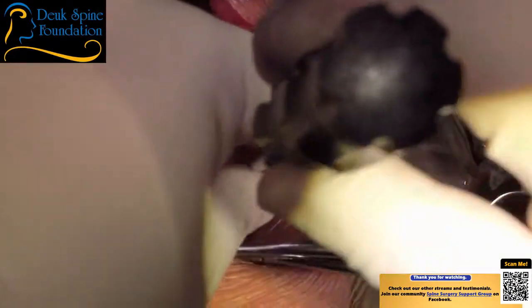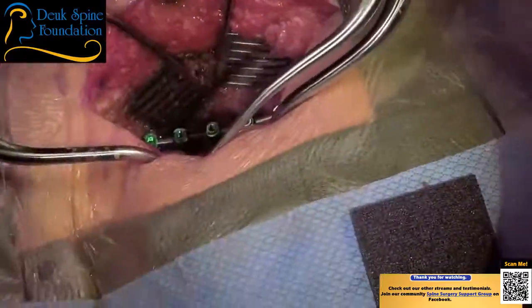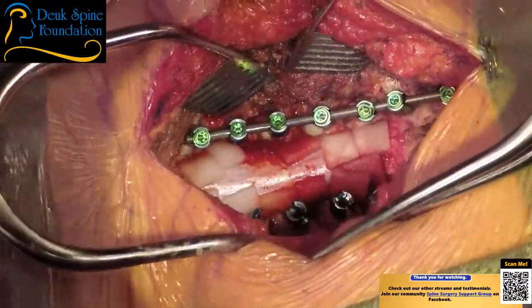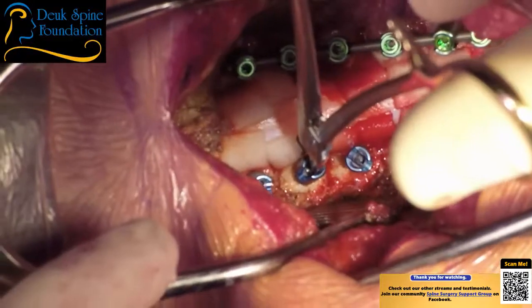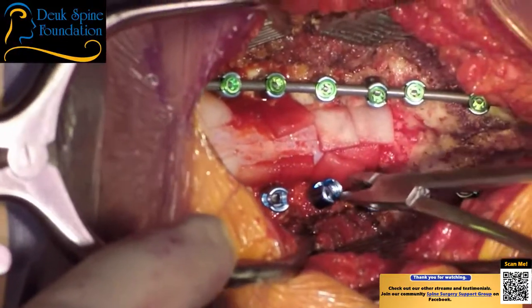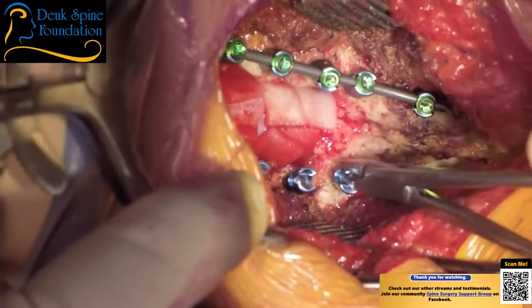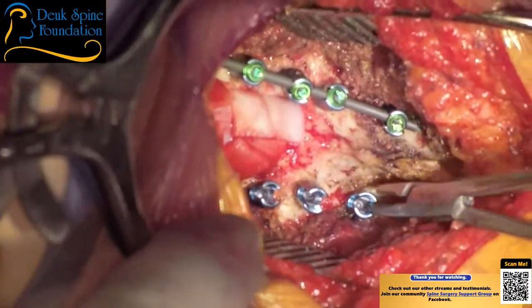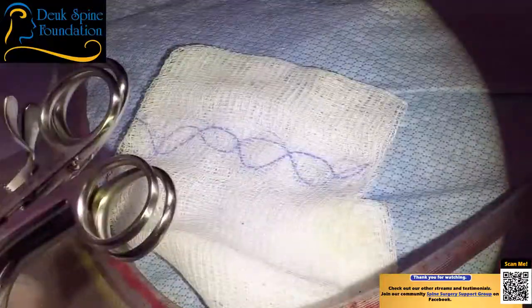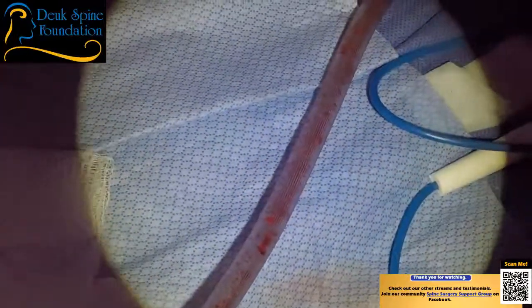All right, good. Let's have the needle holder. We've literally lost 10 mils of blood. Dr. Fu, great job. No, you're doing a great job. Thank you. You're part of the reason. I need to sink this screw in deeper. I need that screwdriver.